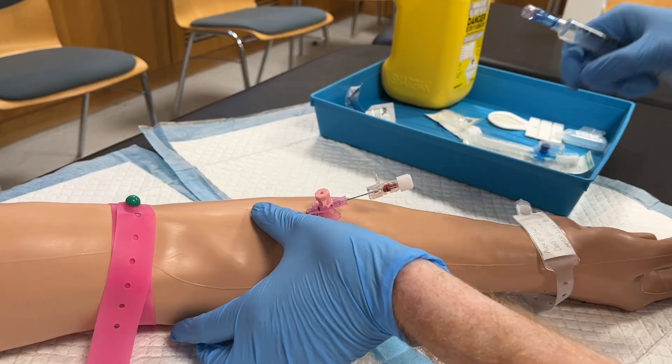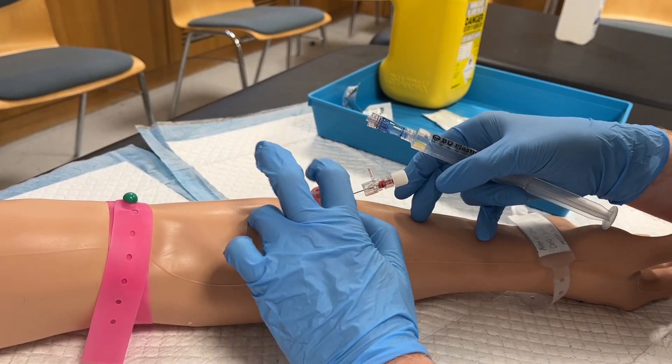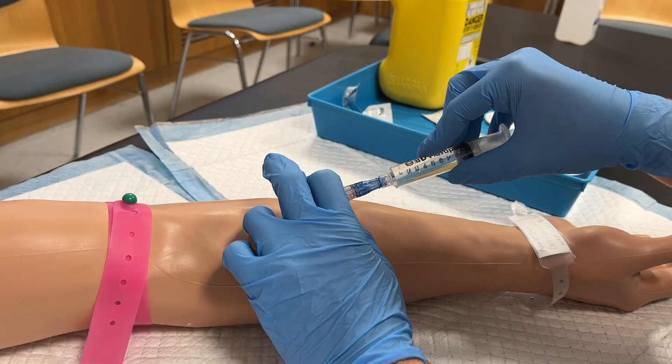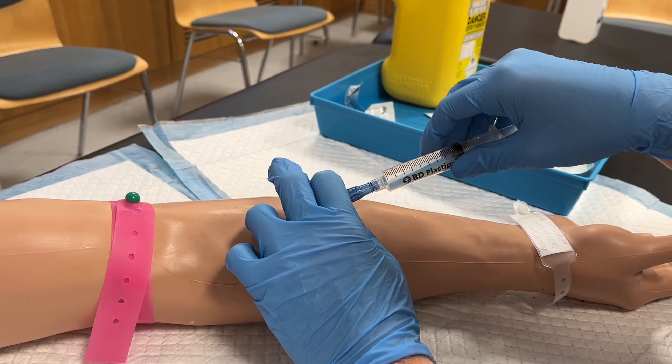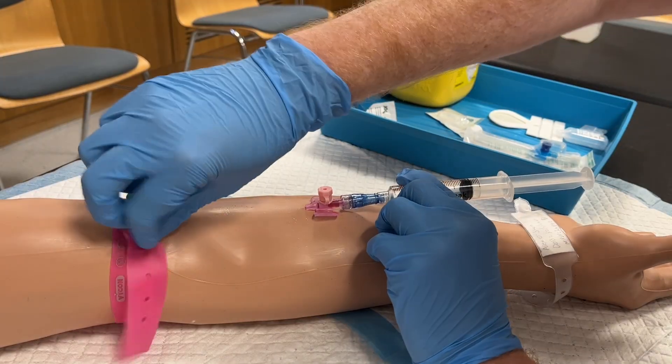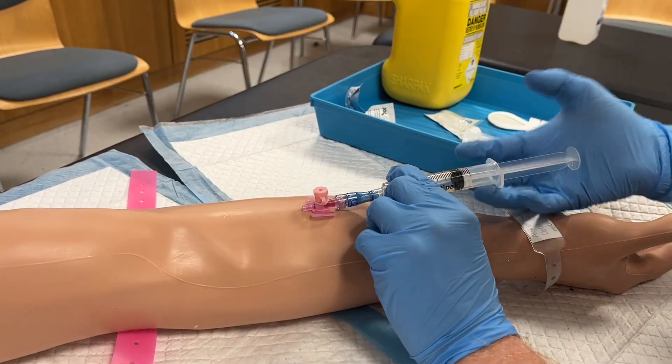You will see me use my non-dominant hand to apply pressure above the cannula to reduce bleeding as the needle is removed, placed in the sharps bin, and the syringe with saline is applied. At this point, the tourniquet is removed, and the cannula is tested with a small flush of saline.